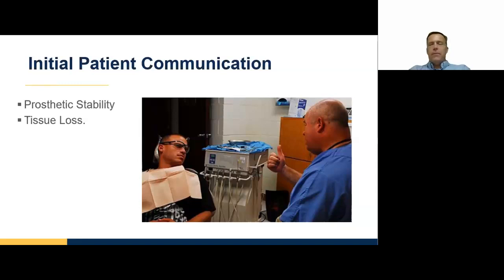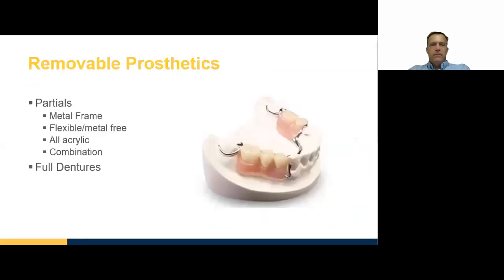If they choose something else, then there's no problems with expectations because we already have had that dialogue at the beginning. So we're going to talk about tooth and tissue supported removable prosthetics today.